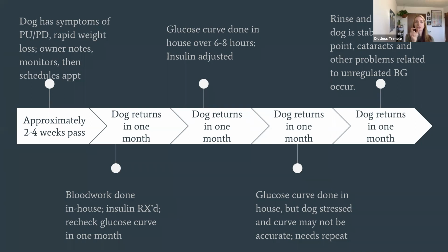So it has a very, very tiny catheter that I believe goes subcutaneously and reads interstitial fluid. So if that gets bumped around, it's not going to read right. So surgical glue, you've got to shave. It does take some prep for this to work, but usually can be done with a little sedation or just a little local. I don't think you really need to do a whole lot to get these things stuck on there.